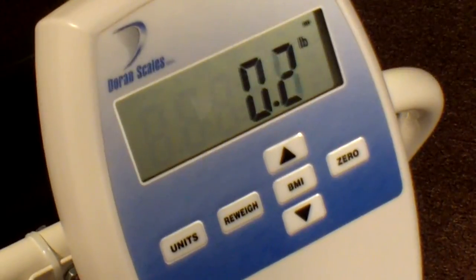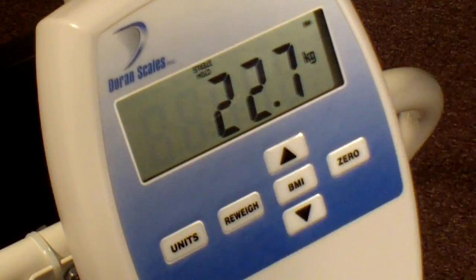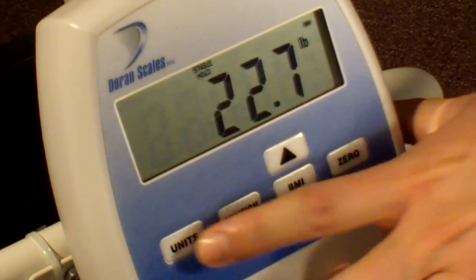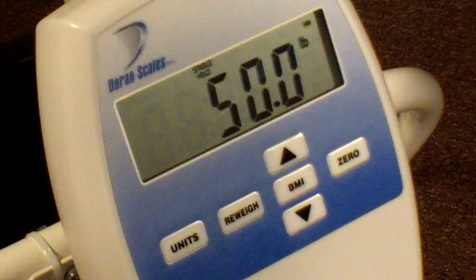The scale will then lock in and display the patient's weight. Press the units button to change between kilograms and pounds — the current weight unit will be displayed to the right of the weight digits. Pressing re-weigh allows you to restart the weighing process without having the patient leave the chair.